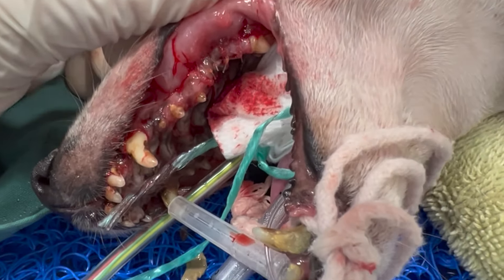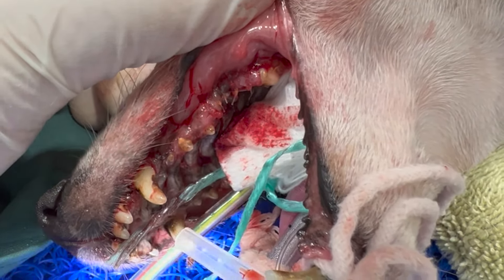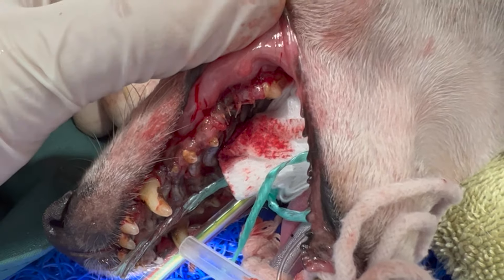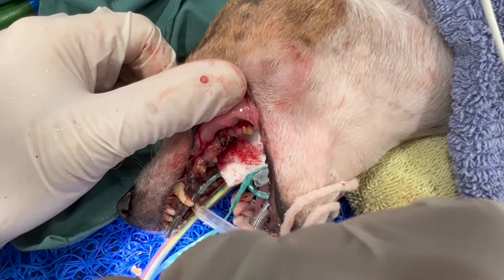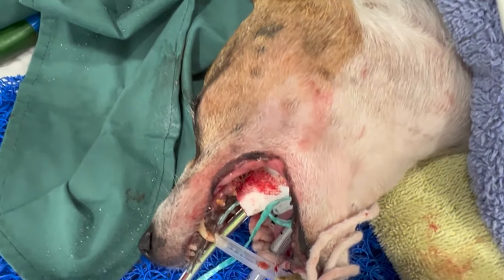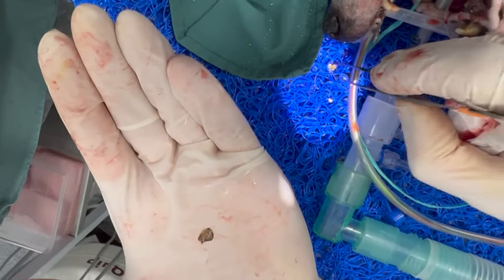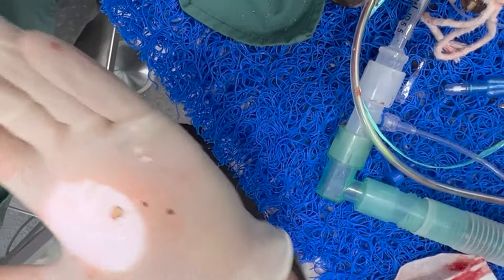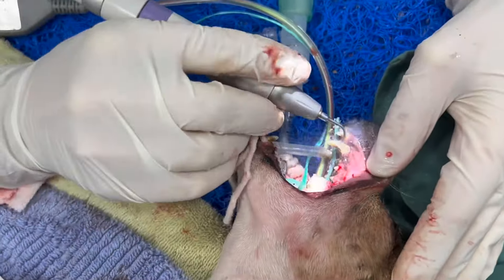We've taken out the carnassial tooth and we'll X-ray to make sure nothing is left. It looks absolutely brilliant — there are six stitches and we've done a gum flap to close it. We've taken out all the pieces of root. You can see the plaque and tartar — how thick it was on this tooth. This dog is going to be a very happy dog at the end of all of this.